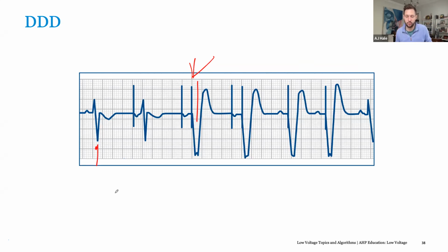Some people I've heard, and once again, you want to read the studies on it yourself, I'm not a doctor, but some electrophysiologists I've worked with will argue that if you're waiting 450 milliseconds, you're doing a disservice to your patient by waiting that long because they're losing that atrial synchrony. They're losing 30% of their output. So you kind of just have to weigh all those factors when you optimize a patient.